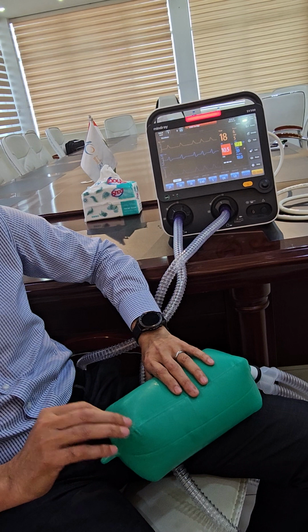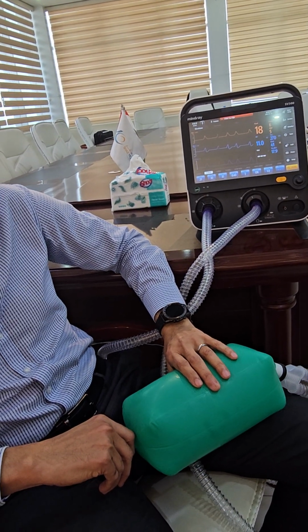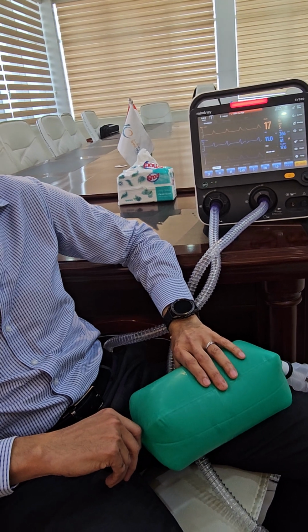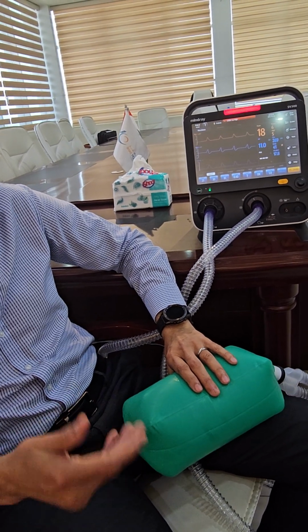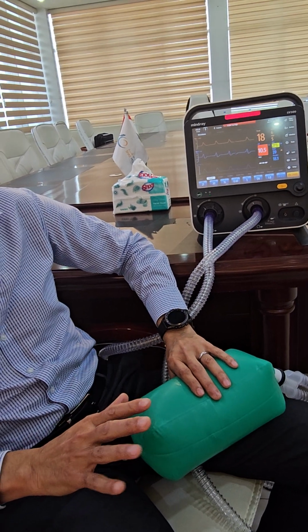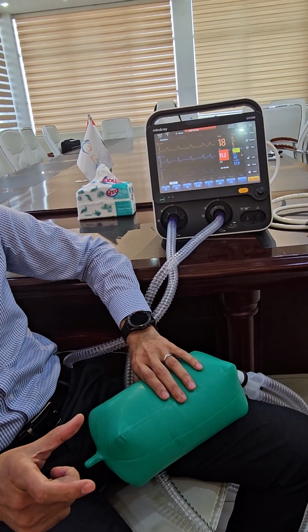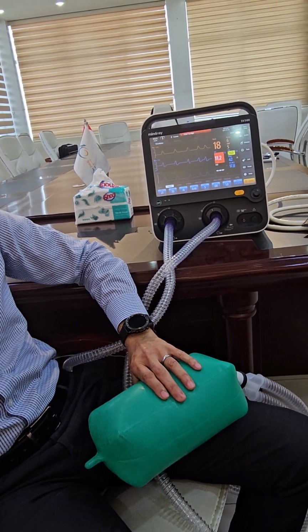Do you understand? In a premature baby, we start with 30%, according to the American Academy of Pediatrics guidelines, or the NRP, the Neonatal Resuscitation Program. We understand this? That does not mean you don't give more FiO2, but you give it temporarily until you solve the problem. How? You escalate the support.